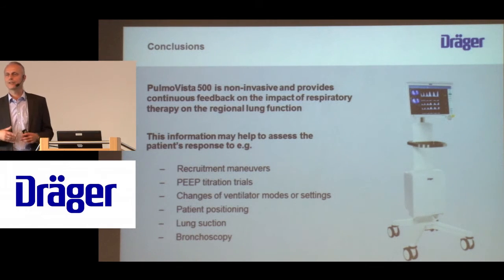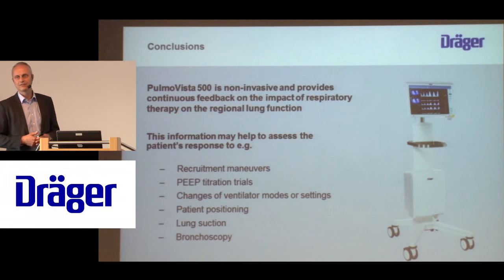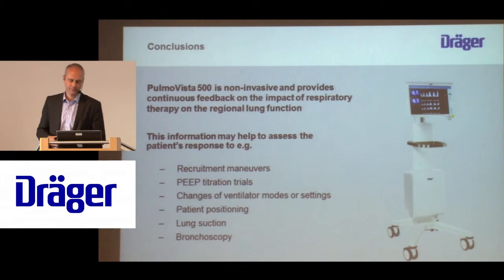Unfortunately, we do not have a lot of data on that, but I'm sure we will see these data pretty soon. You could also assess ventilation and compare the effects of prone positioning, lung suction, and bronchoscopy. Thank you very much.